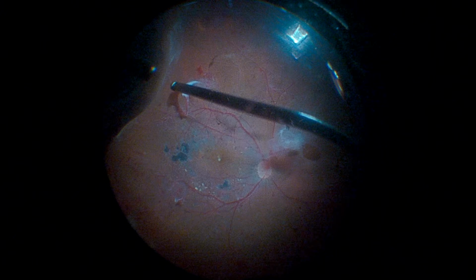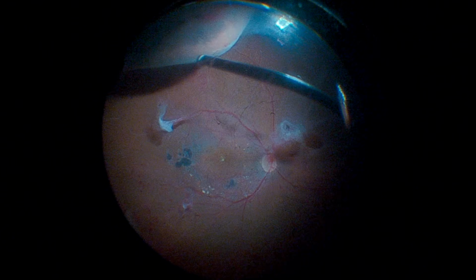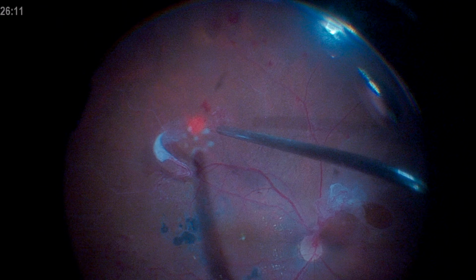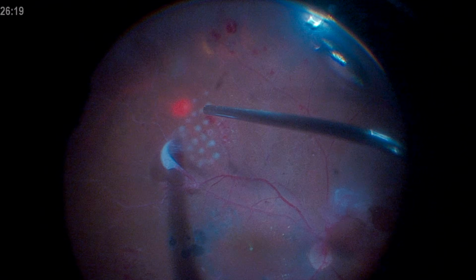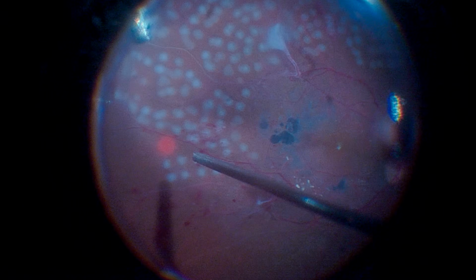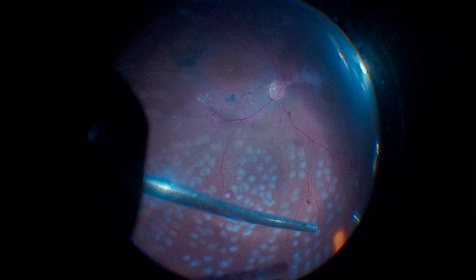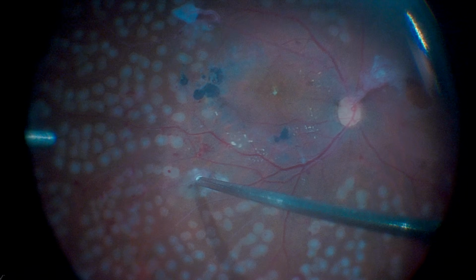Next, the vitreous base shaving is carried out. At this point, panretinal photocoagulation with endolaser is performed to ensure treatment of the attached retina before addressing the traction areas. This approach ensures treatment of the entire ischemic retina before addressing the fibrovascular tissues. After panretinal photocoagulation, the traction points are approached.